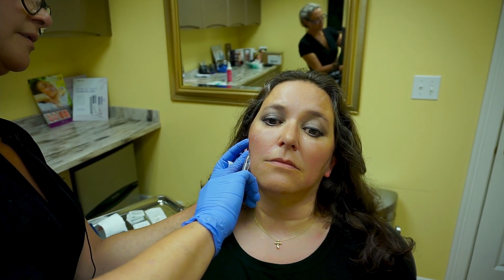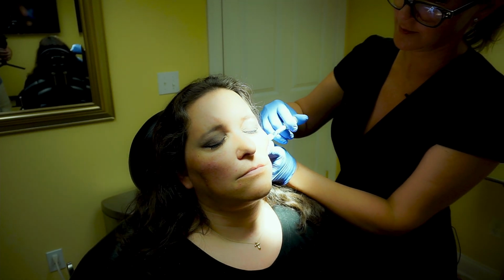So the indications for this filler is for the mid-face and cheek. And that's what we're using it for here. There. That's one side done. So I'm just doing the other side to balance the first side.